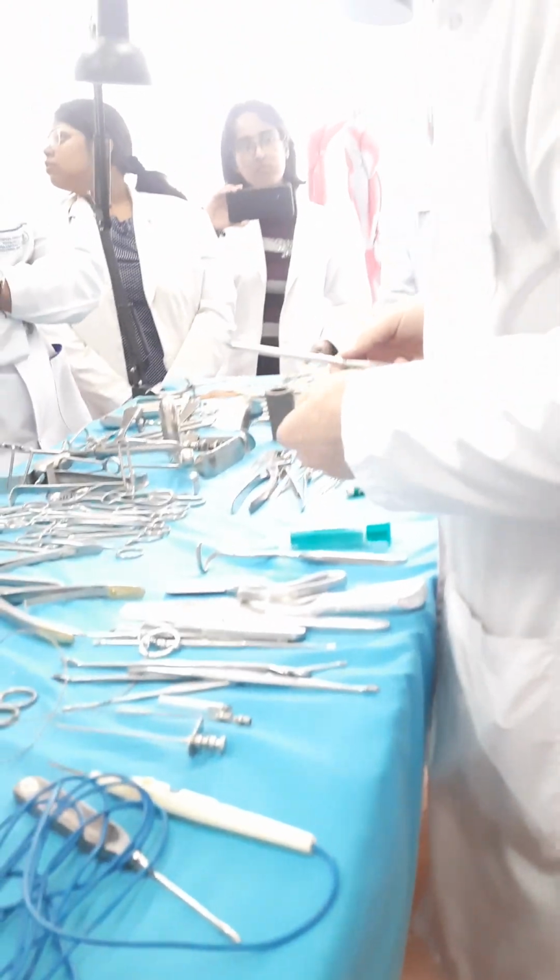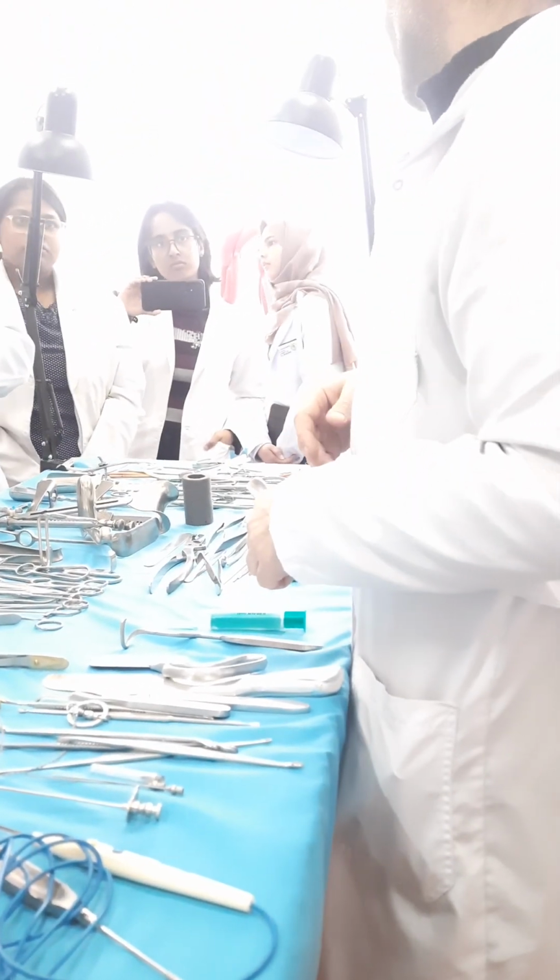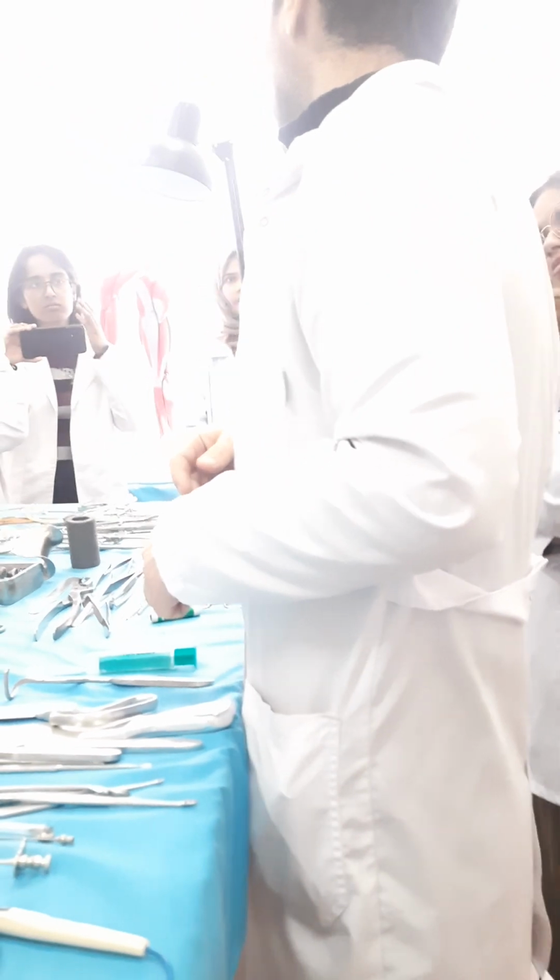So we insert some. You can insert, you can remove, you can inject, you can make laparoscopic manipulation.